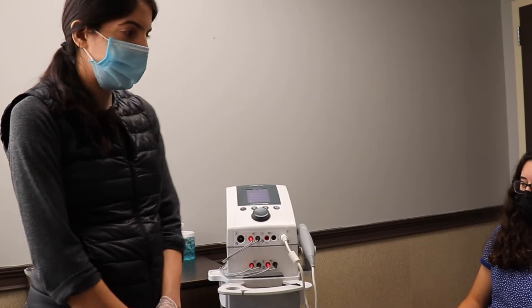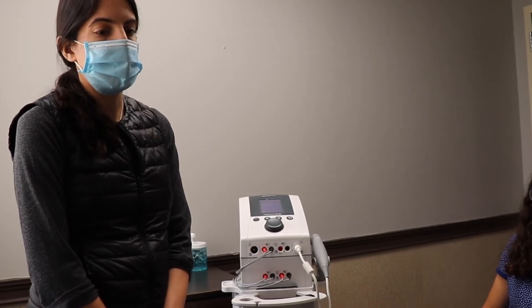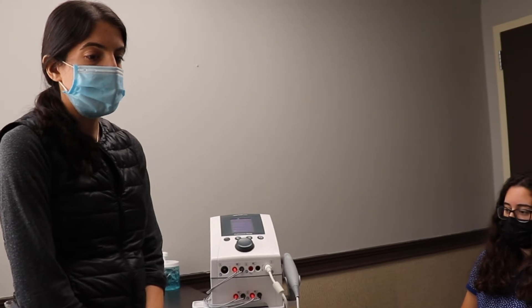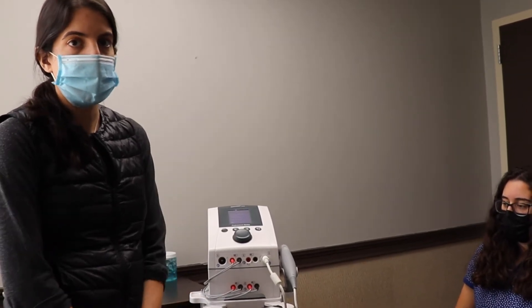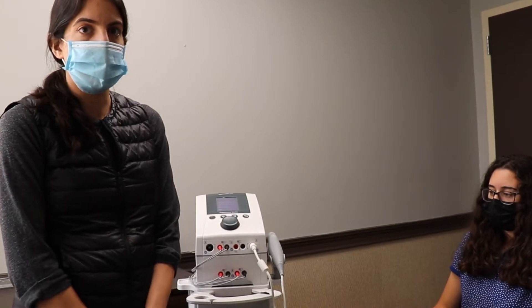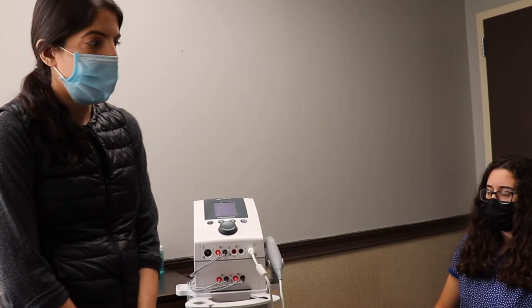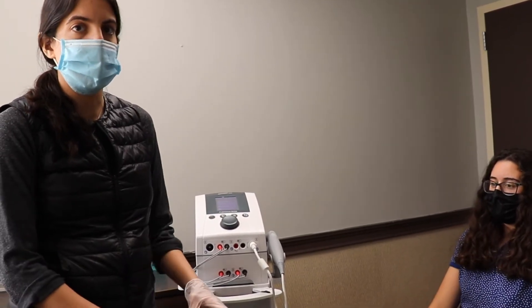With ultrasound we're administering sound waves into the patient. The use of these sound waves is to help decrease inflammation, help increase blood flow, and help with chronic pain. The chronic kind of pain this will usually help with involves soft tissue, so it could be anything like a bursitis or a tendonitis. It's usually more effective with smaller areas of the body.